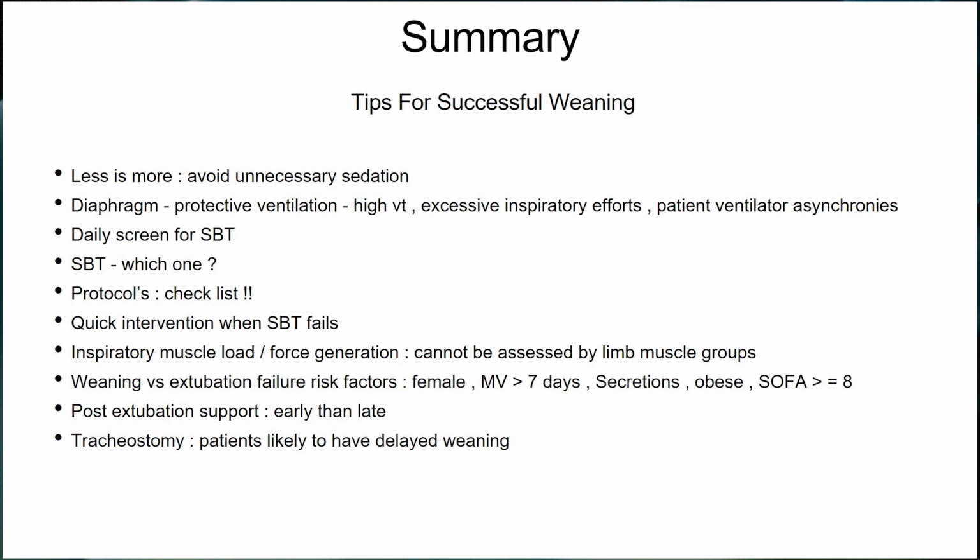Have protocols with respect to ventilator, with respect to sedation, with respect to physiotherapy, with respect to nutrition. They make a tremendous impact on weaning patients. And if the patient fails an SBT, don't wait. Get the patient back onto complete ventilatory support. Pushing the patient when an SBT fails is not going to help you.